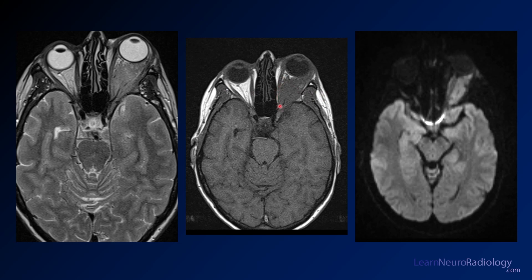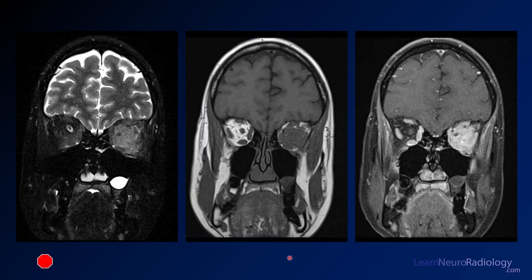On T1, there's loss of the normal orbital fat and loss of the planes of the extraocular muscles — for instance, you lose the medial rectus. On diffusion, there's intermediate diffusion signal within the orbit, which is abnormal since you really shouldn't be seeing anything there at all.